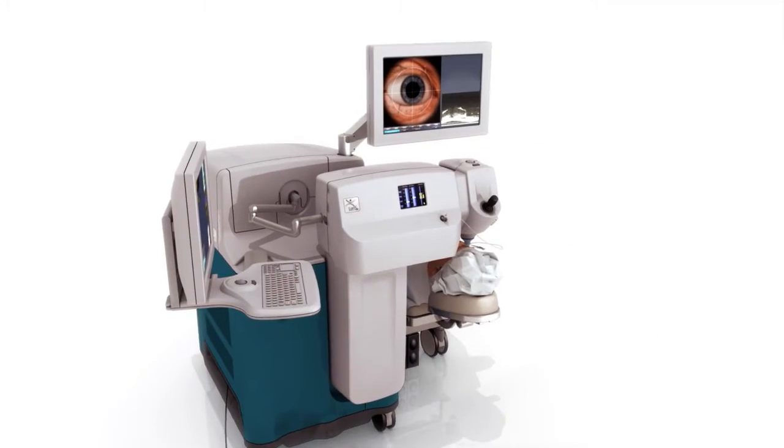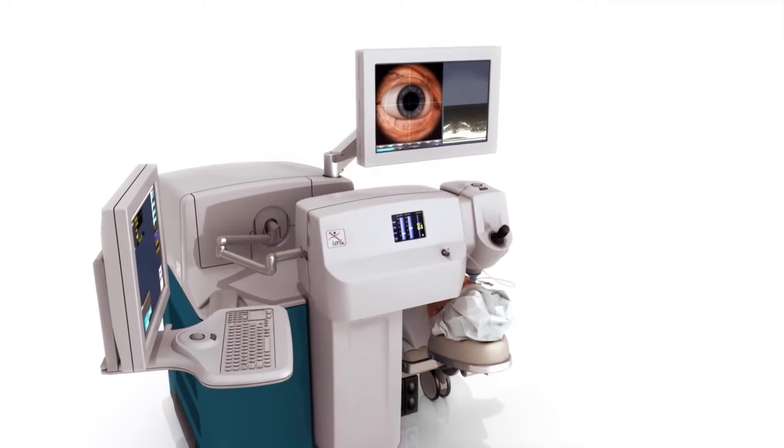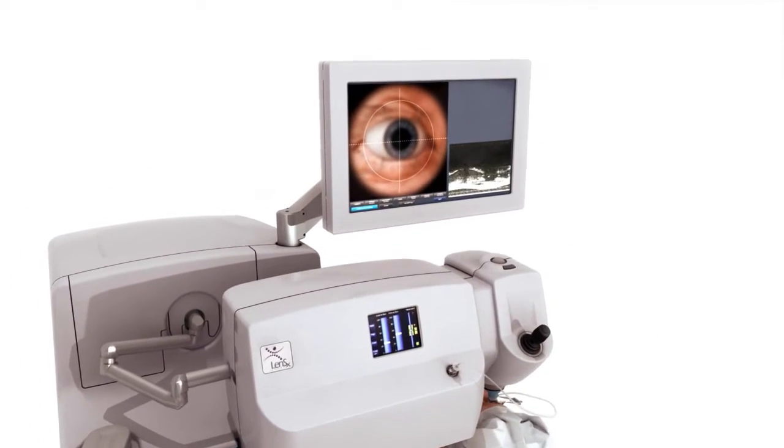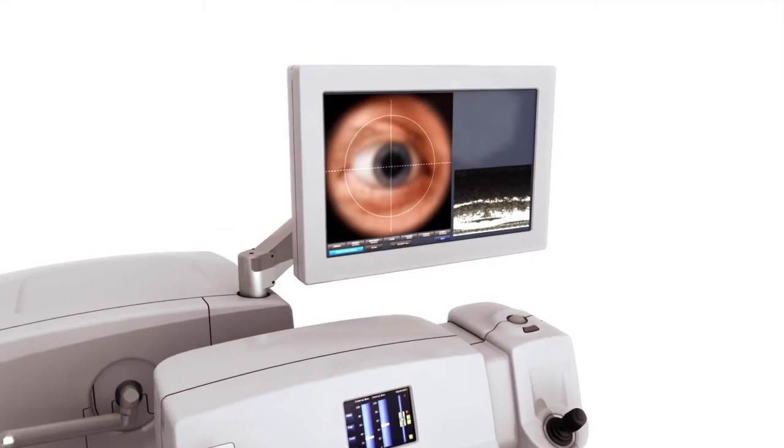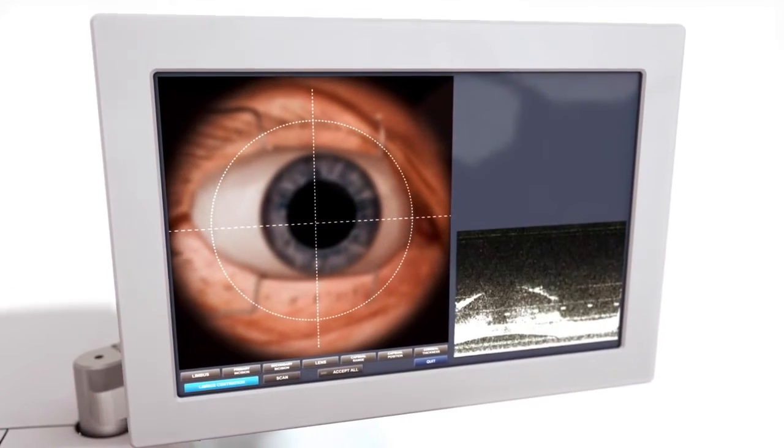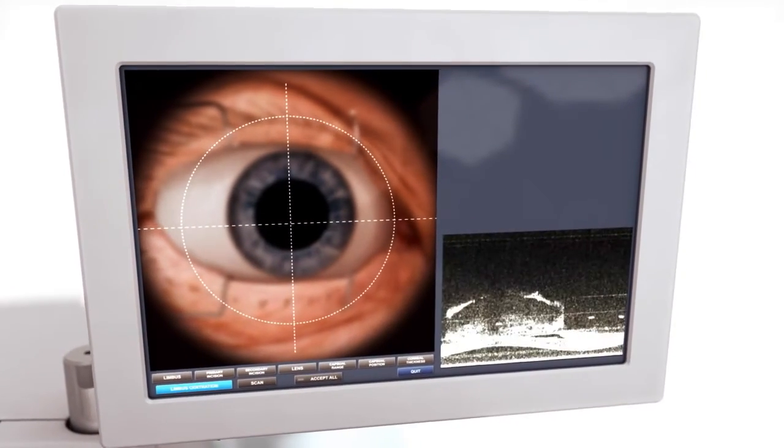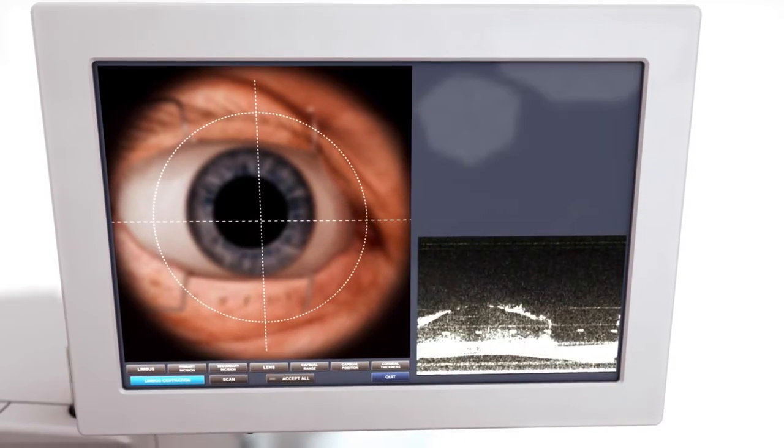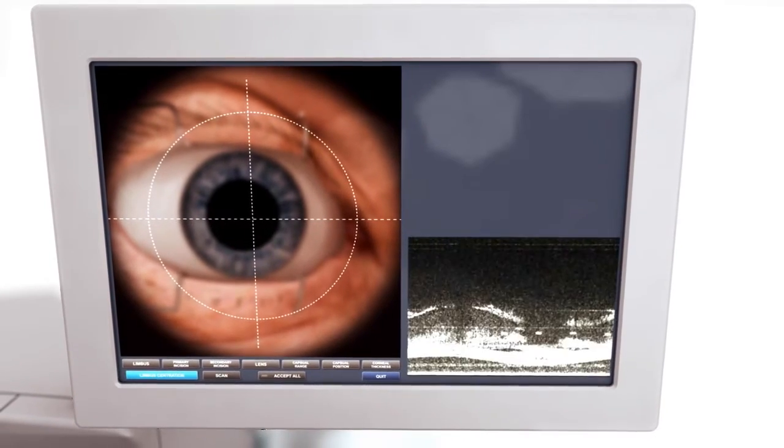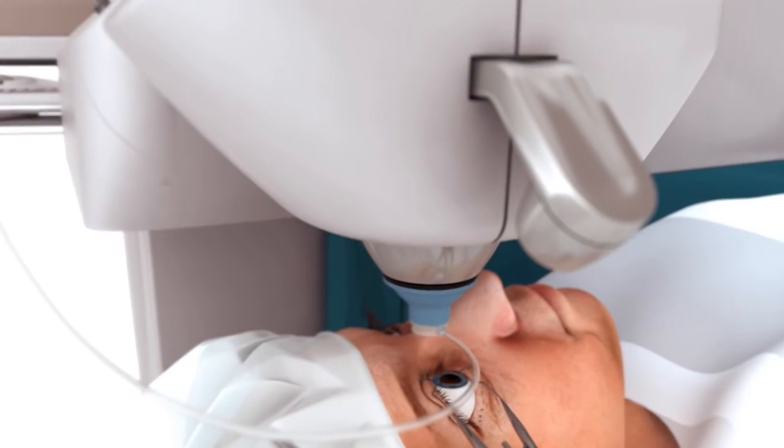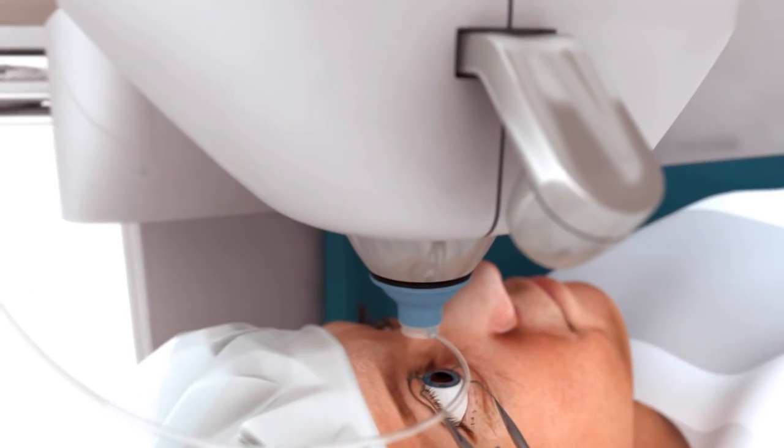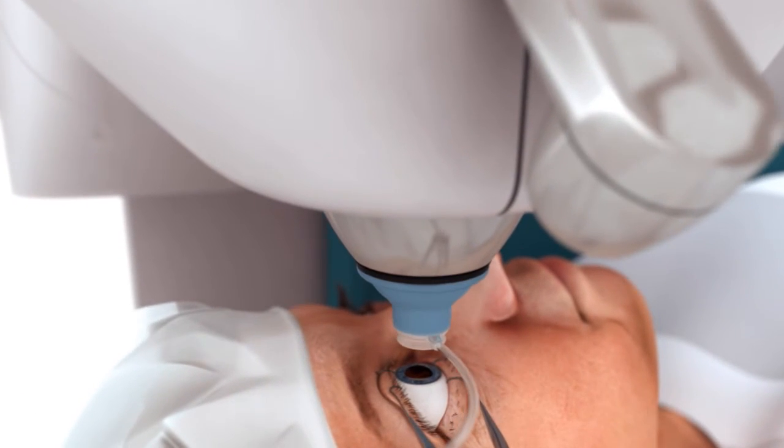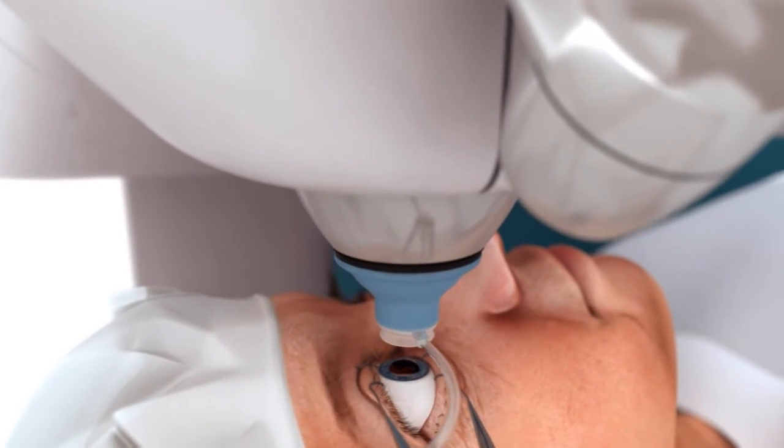The LensX laser is designed to provide patients with an optimized refractive cataract surgery experience. Featuring real-time imaging and integrated OCT, the LensX laser allows for visualization of the entire anterior segment during docking, planning and procedure.